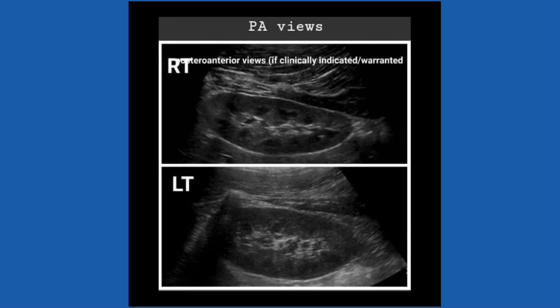This last part may not be routine in most labs, but once you're done with the sagittal images in supine, ask the patient to move prone for posterior-anterior views. Once the patient has gotten over the confusion of whether to turn left or right, you're ready to begin scanning in PA. Sometimes you can get a little bit more accurate measurements in the PA views.